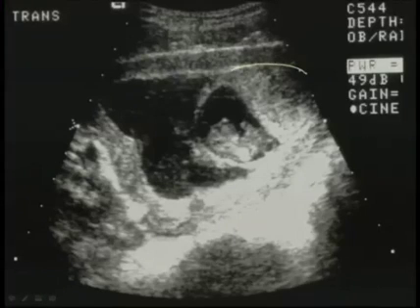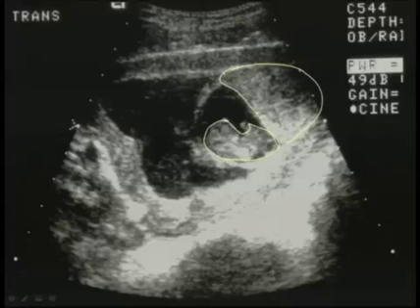Here's an example of a subchorionic bleed. Here's the placenta. This, of course, is the embryo here. But you can see here that a margin of the placenta has been lifted up. And then there's all this low-level echoes in this fluid collection to one side. And that is blood, in this case, of subchorionic hemorrhage.